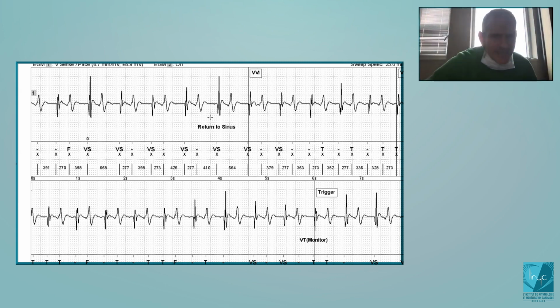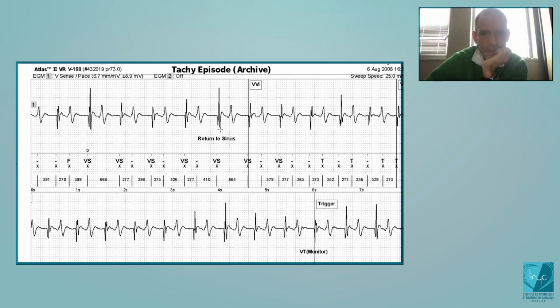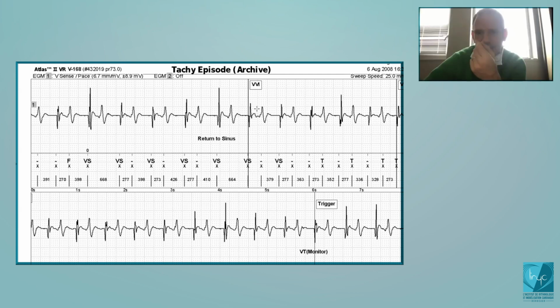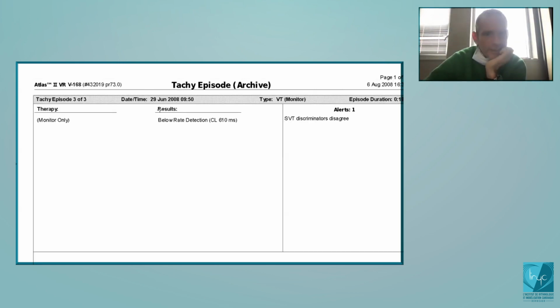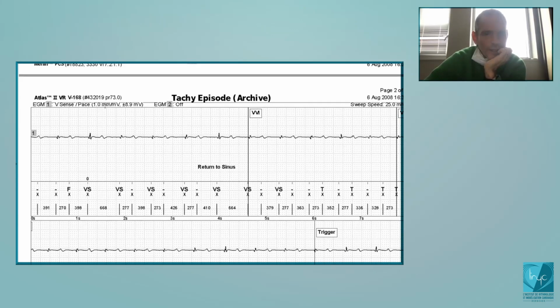You see, anytime you need to understand that when you have a look at this, the impression that you have is that this R wave is of quite high amplitude. You don't understand easily and visually that these R waves are very small, but it depends on the calibration. You see, it's 6.7 millimeters. So if you change the calibration, now it's 1 millimeter by millivolt, then you understand the problem.